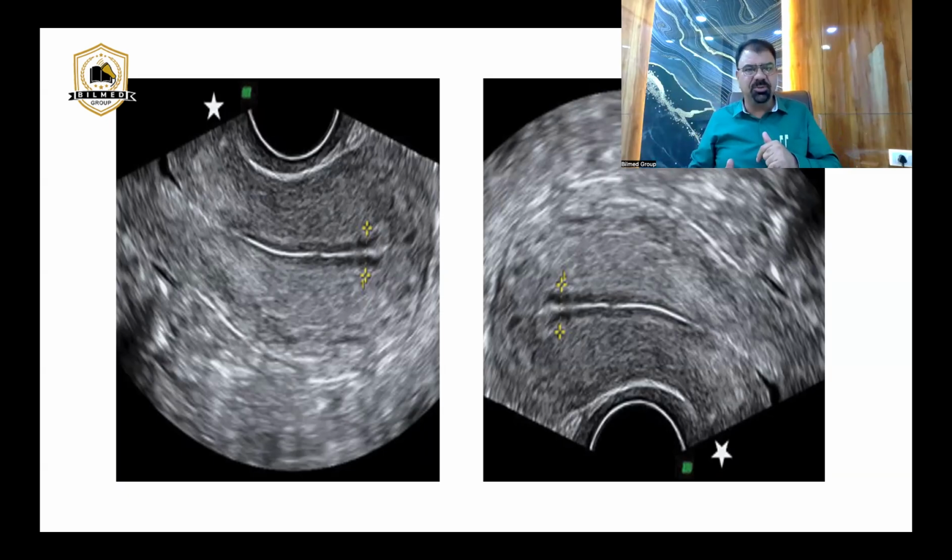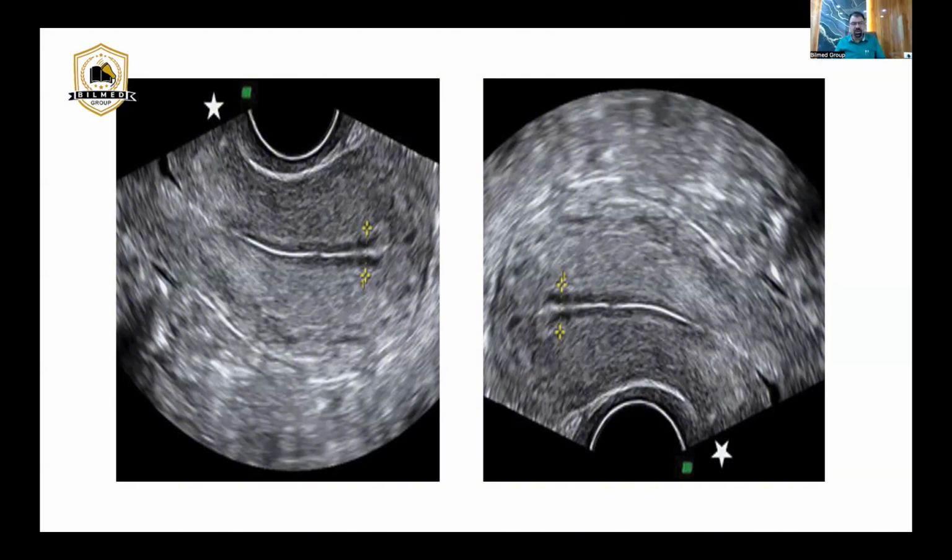In your chat boxes, others, please. Now, will it remain same, increase, or decrease? Let me open the chat box. Hypoechoic, Dr. Vandana Gupta, very good. Now, I got the answer, hypoechoic. So, if it is inflammation, anywhere in the body, the echogenicity has to drop.